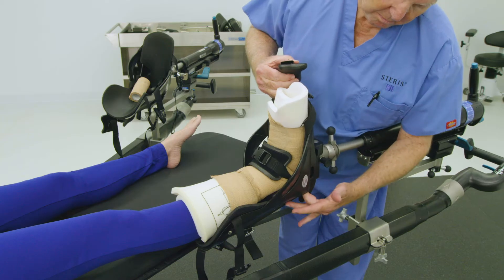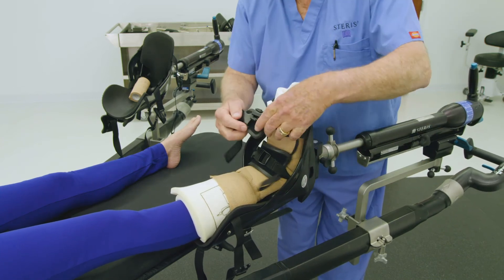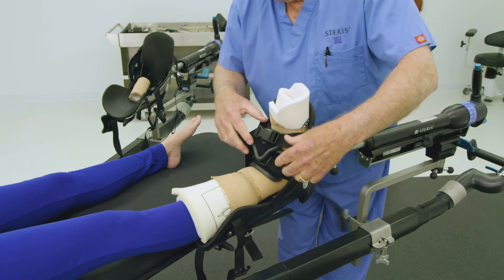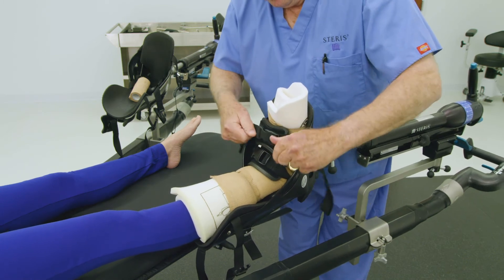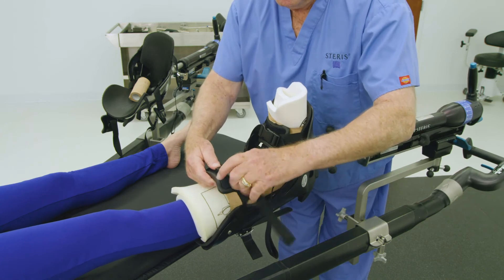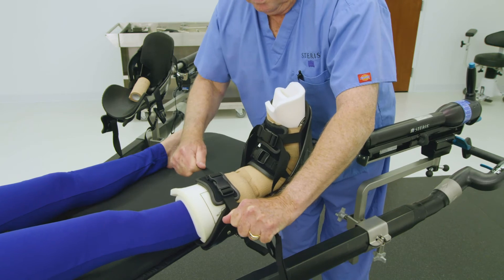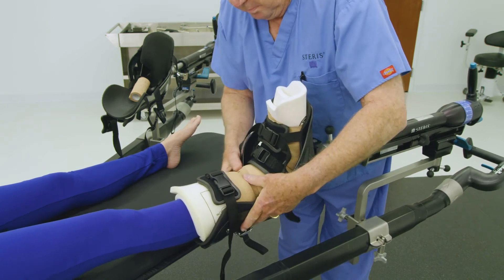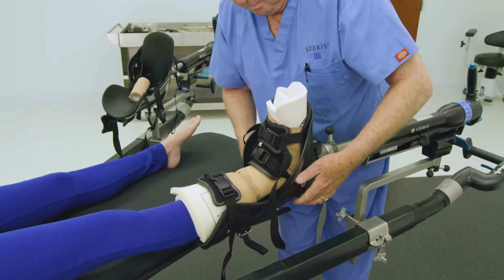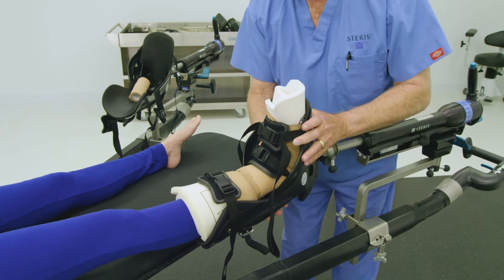Finally, buckle the toe and calf straps and tighten straps securely. Ensure all buckles are centered. Failure to follow these steps could lead to the patient's foot slipping out of the traction boot. Repeat these steps with the other patient foot as clinically necessary. Some orthopedic procedures may only require one patient foot in leg traction; a universal leg holder will be used for the other leg in these unilateral situations.